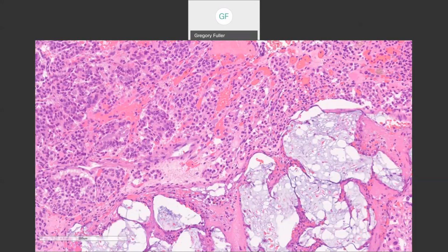I think Sergio may just have gotten it. These things go by so fast. It's on my little screen, the laptop, so I apologize for not catching all the guesses. Anybody want to chime in? What is that stuff in the lower right, and how does it help you narrow the diagnosis? It doesn't have to be absolute, but narrow the diagnosis greatly.